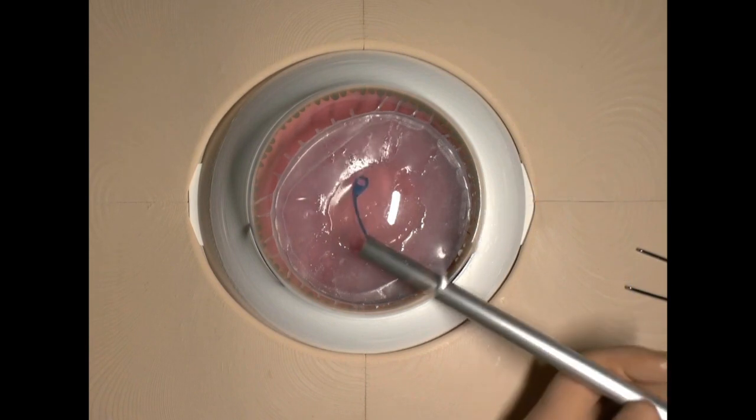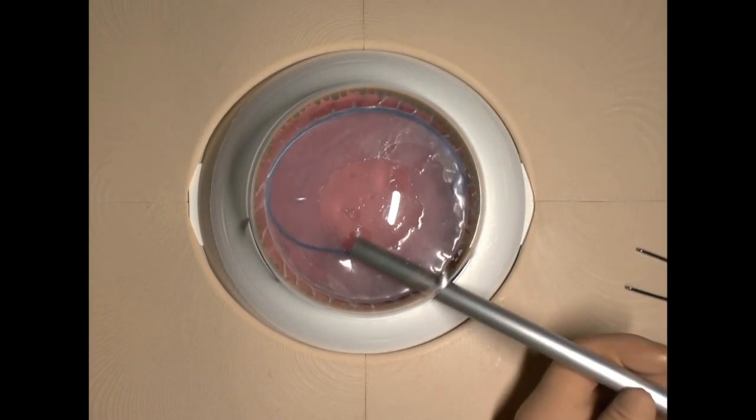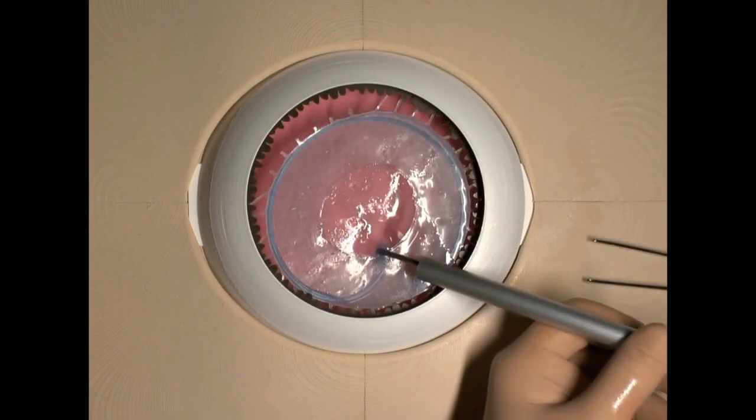Capsular tension ring is perfect solution to zonular damage in a limited sector. It can be implanted by forceps or an injector.